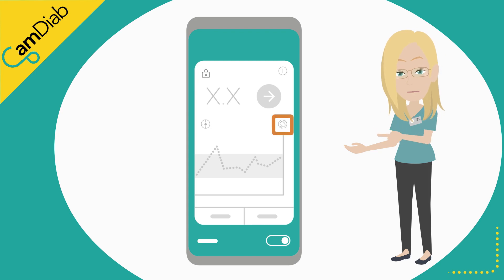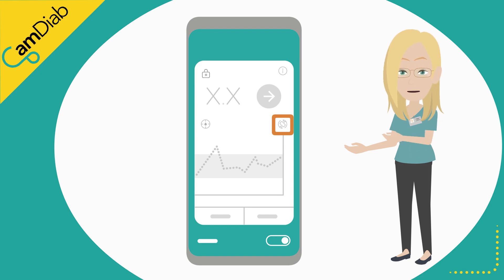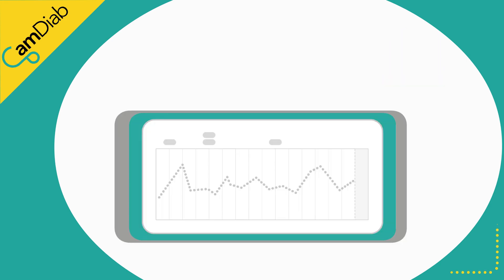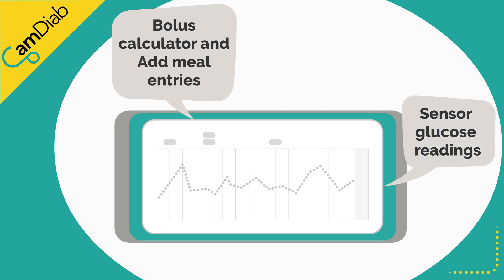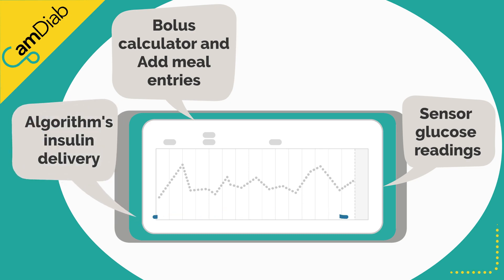By tapping on this icon or turning your phone to landscape, you are able to see a detailed graph. At the top of the graph, you can see carbohydrates and insulin given via the bolus calculator or when carbohydrates are entered via the admin function. The sensor glucose readings are in the middle of the graph.